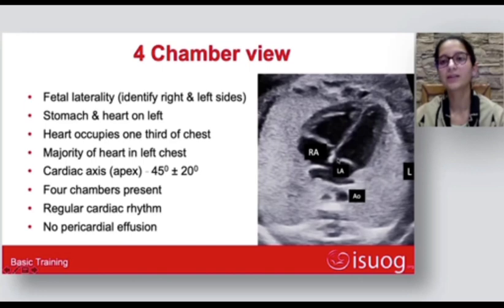What we appreciate here is this normal offset between the tricuspid and the mitral valves, and what this implies is that the tricuspid valve is normally slightly more apically situated as compared to the mitral valve. Also, the right ventricle, which is the most anterior chamber of the heart and is situated beneath the sternum, has this band of muscular tissue at its apex, which is known as the moderator band and is the signature for identifying the right ventricle. On the other hand, the left ventricle has relatively smooth inner walls and is devoid of this moderator band. It is the left ventricle which forms the cardiac apex.